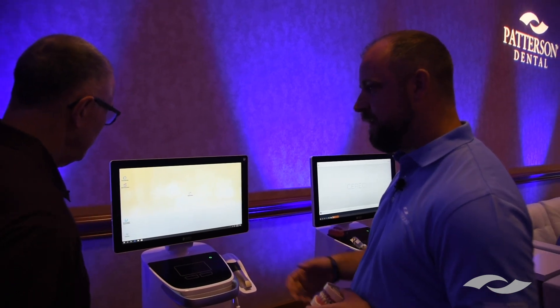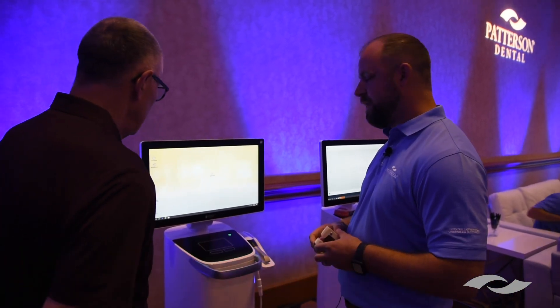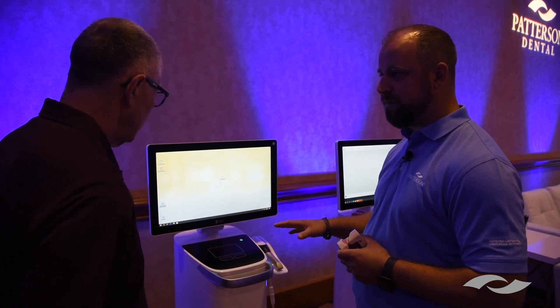This is Dentsply's new scanner. You can buy this as a digital impression system or pair it with a milling unit for a full CAD-CAM. If you want to do in-office milling hooked to a 3D printer, it's a fully open system.